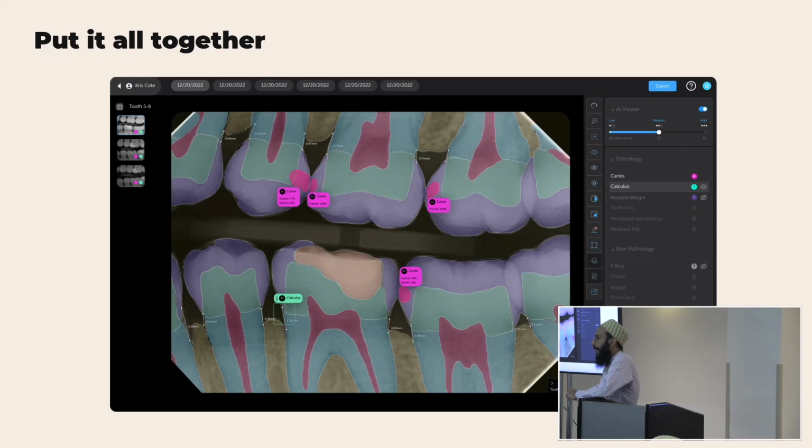So the experts were radiologists, and the readers, which were the 25. So there were 4 experts, right? The 4 experts were radiology teachers at prominent universities that teach dentists how to read radiographs. That's what I'm asking. So radiologists, the interpretation of a radiologist versus the interpretation of a dentist or anybody else is going to be vastly different.